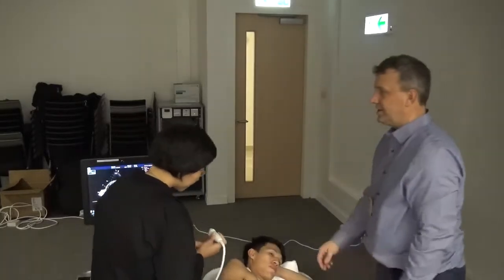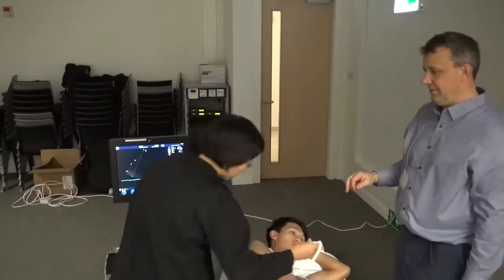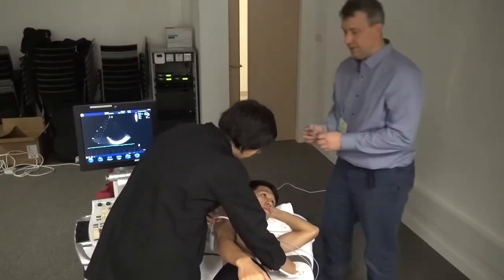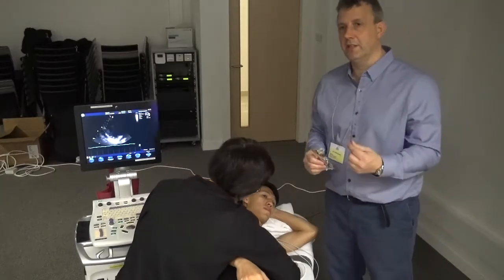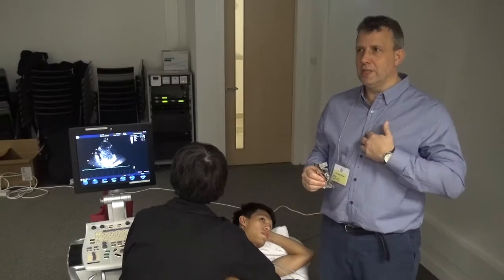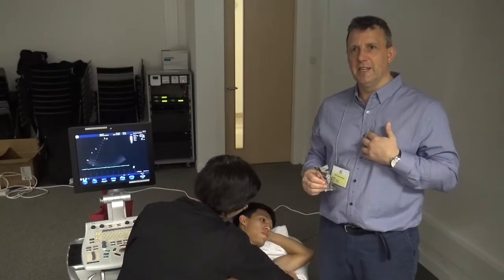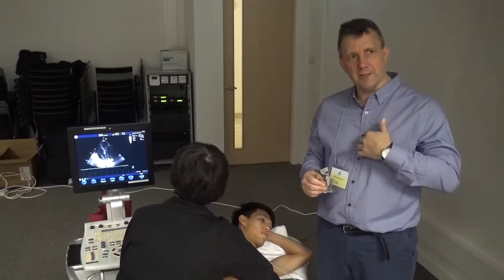Right, so I'm going to start you. We're going to go to the apical window. Now, one of the things I was saying to the other groups is that when you're doing the parasternal window, you've not really got much choice. You know where the sternum is, you know where the edge of it is, you know where the rib space is. You sort of can't go wrong. If it's not there, it's the next space up.